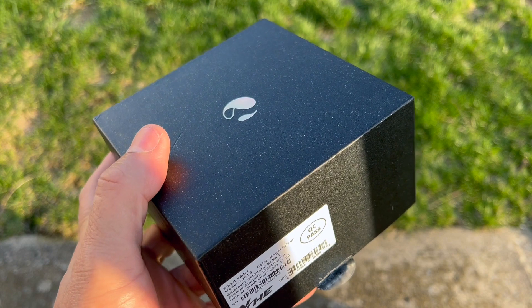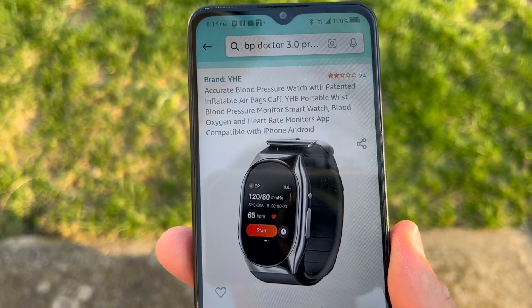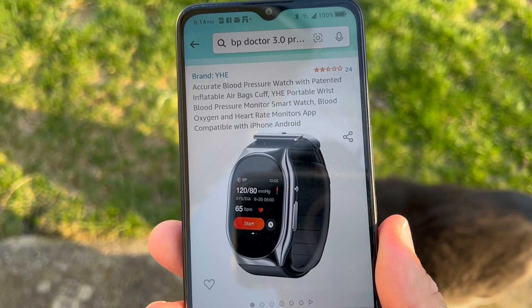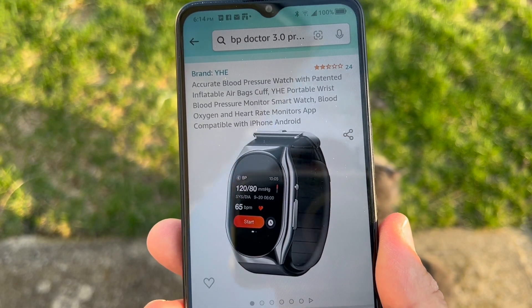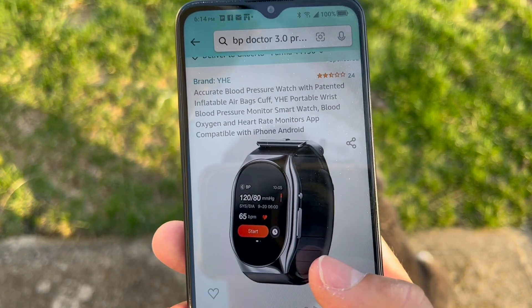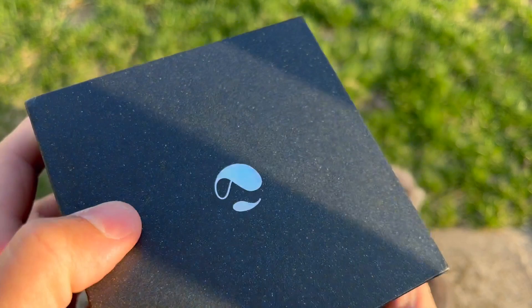What's going on YouTube, Tony here back again with another video. Today we are going to be checking out the Yee accurate blood pressure watch. It does have an inflatable airbag cuff — it's a portable blood pressure monitoring smartwatch. I've been using this for a little while. It also monitors your blood oxygen, heart rate, and sleep. Let's jump into the box and see what you get.